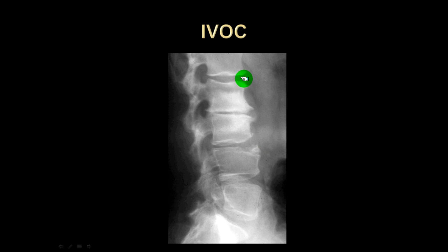In addition to these radiographic findings that are seen in the spine, there is also some vertically oriented patchy calcification identified within some prevertebral structures anterior to the spine here.